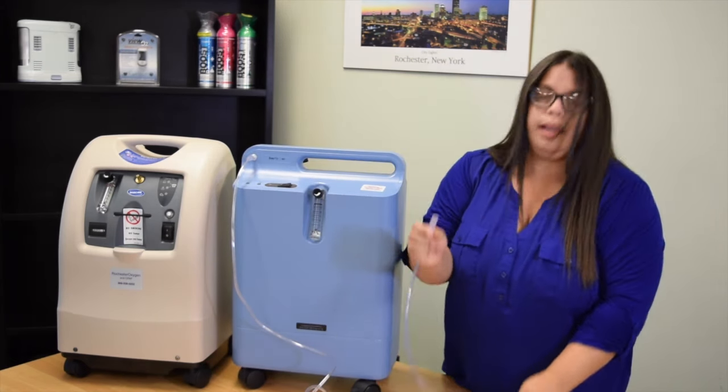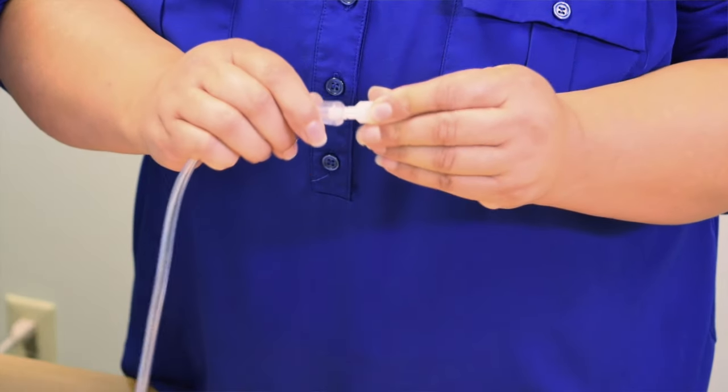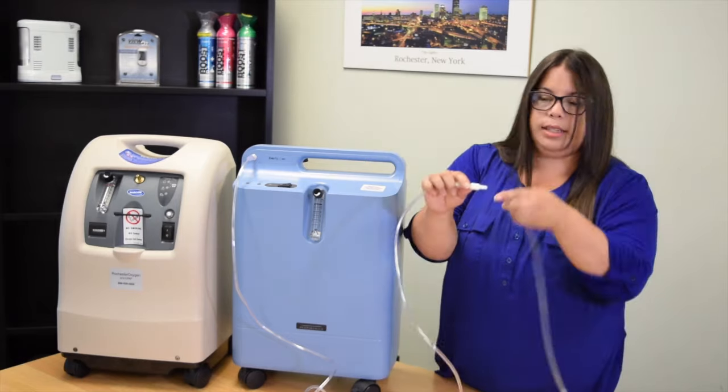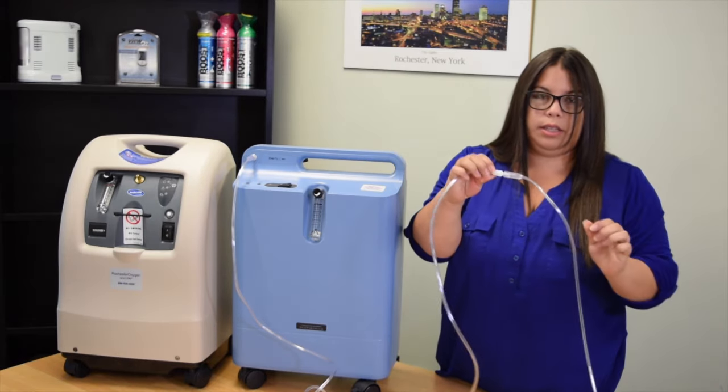The other end we're going to take and put it on the swivel connector, and then we're going to take our cannula and connect it to the other side like so.